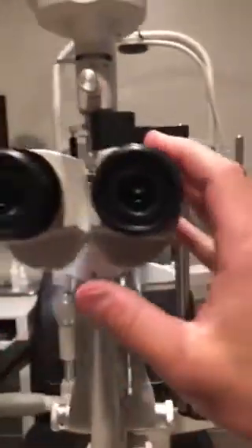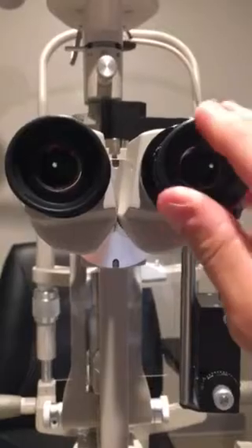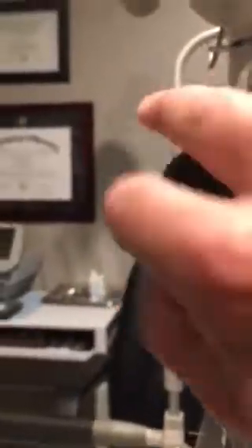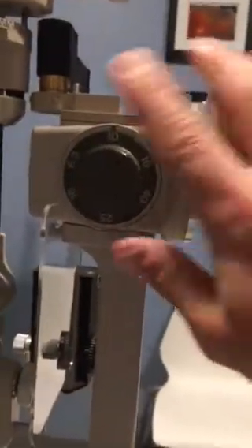We have on the slit lamp the tower portion and the ocular portion. The ocular portion is most important for the provider. These oculars — one goes for each eye. If we wear glasses, these will be rolled up. If we do not wear glasses, you will unroll them so that we have good optics looking into the oculars. These will give us magnification. We can get more magnification on the side of the oculars.